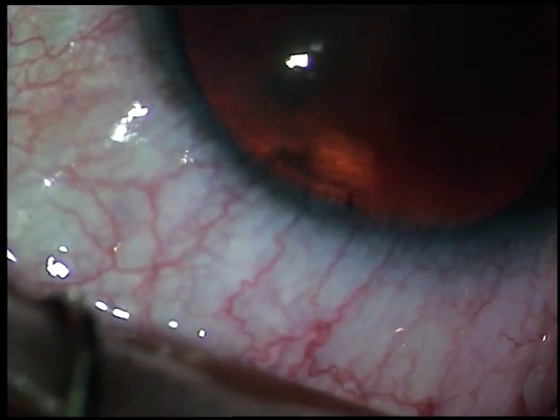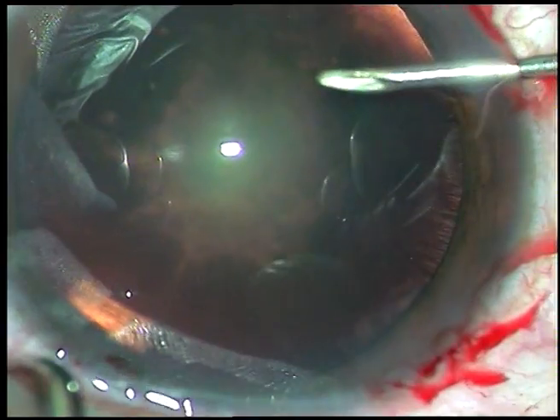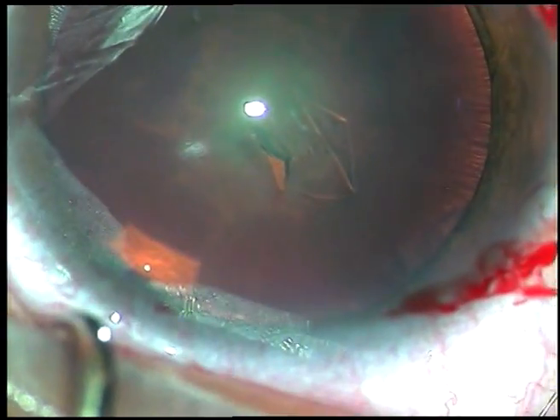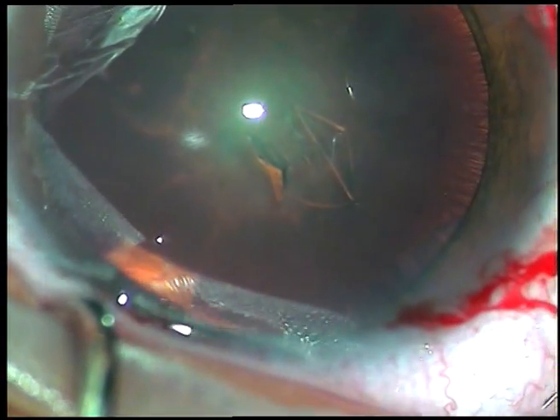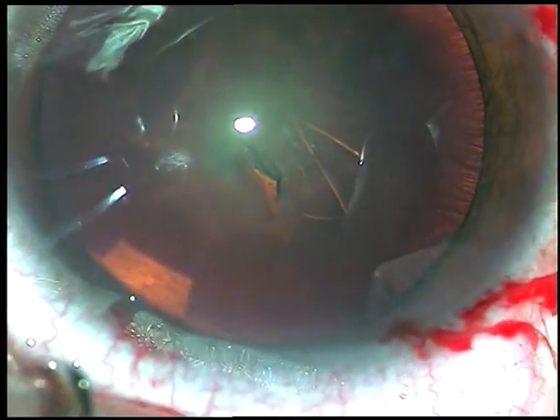Phacoaspiration means the lens matter is so soft that you don't need any ultrasonic energy to emulsify the lens matter. You can just use vacuum to aspirate the lens matter.